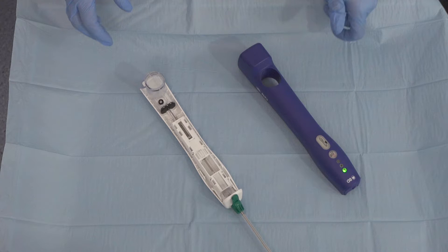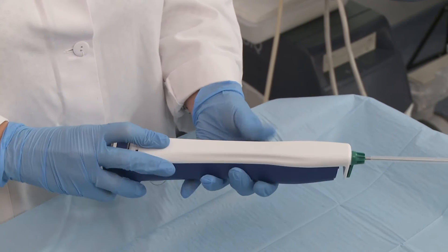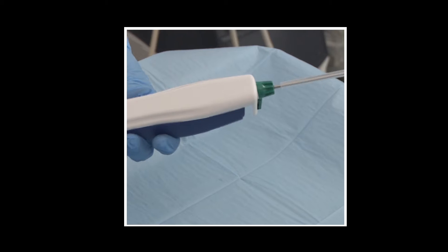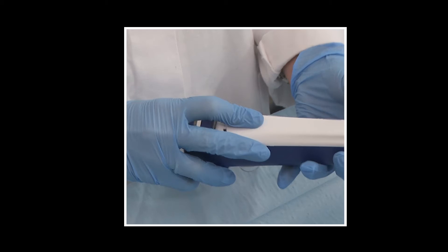Option 2: Remove the probe from the package using an aseptic technique by grasping the probe from below, then carefully align probe tabs and sample container with corresponding driver slots, and firmly slide the probe back to lock into place.